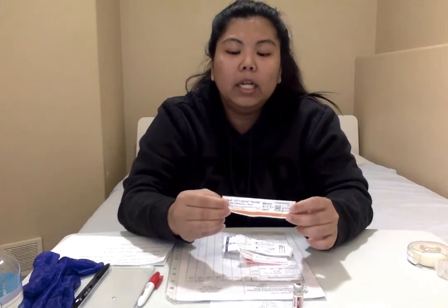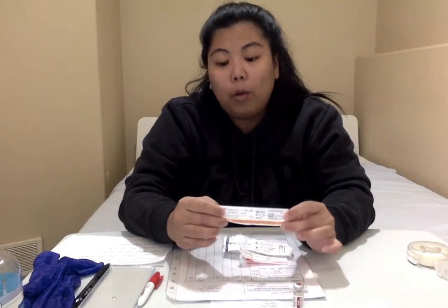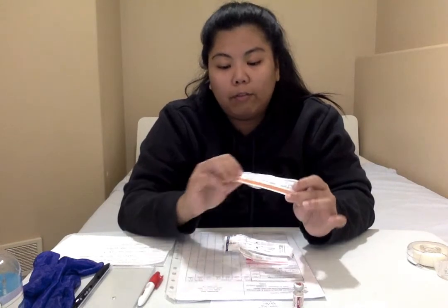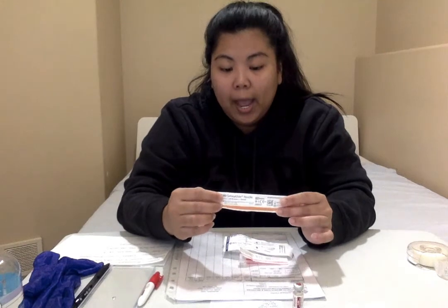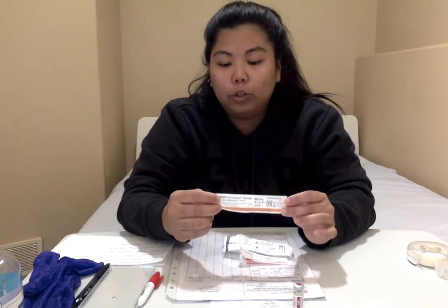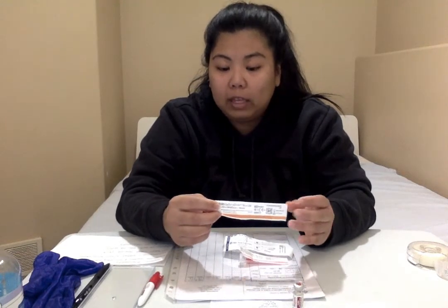And then for the needle, I've chosen a 25 gauge needle. So with subcut, you can choose between 25 to 31 gauge. And then for the length, I've chosen 5/8 of an inch. But for subcut, you can either choose half an inch or 5/8 of an inch needle. So this is what I've chosen.